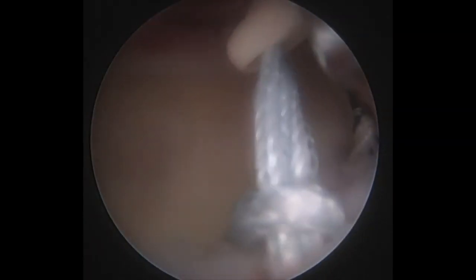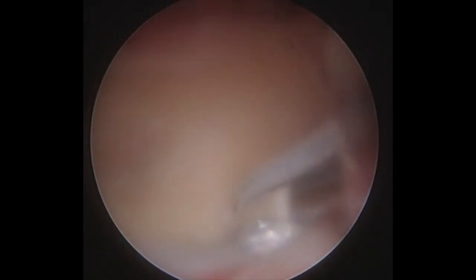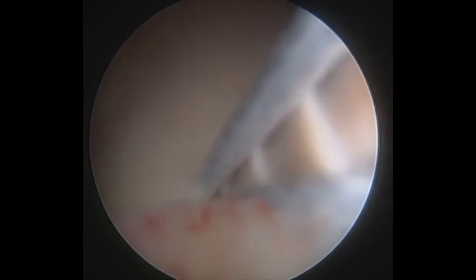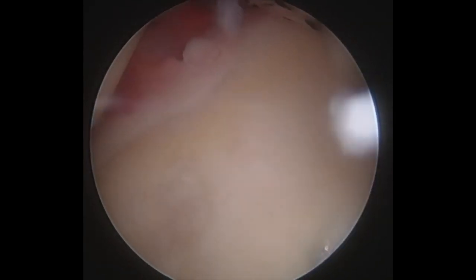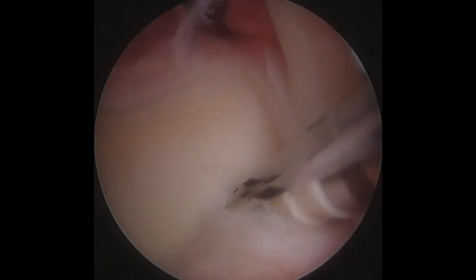This essentially secures a knot around the labrum so that it can control the labral tissue. Viewing the same shoulder once again from a posterior viewing portal, the white piece of plastic you see is part of the suture anchor which will fix the labrum, inserted through a very small incision. The labrum has been secured with a high-strength suture which is then attached to the suture anchor. The suture anchor is then gently malleted. After the anchor is malleted down, I use arthroscopic scissors to cut the excess suture. Typically for a superior labral repair, I fix the labrum with two to three suture anchors, thus completing the repair.